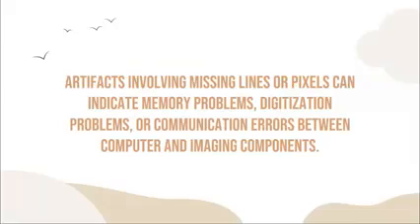Artifacts involving missing lines or pixels can indicate memory problems, digitization problems, or communication errors between computers and imaging components. Okay, example of pixel dropout for entire rows of pixels. Itong nasa sunod, wait lang. Software can compensate for moderate cases by interpolating and filling these pixels.